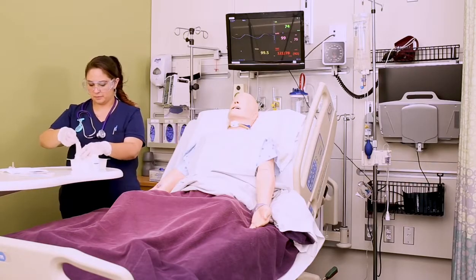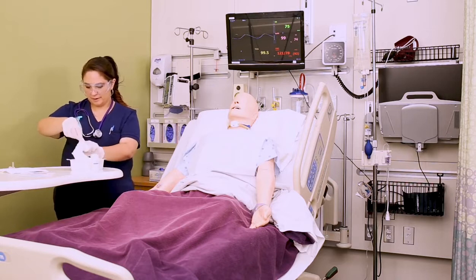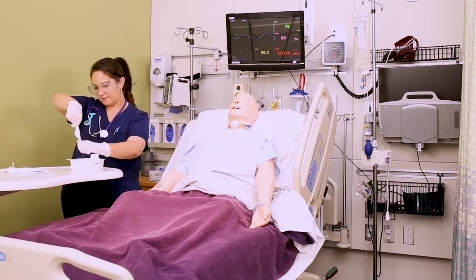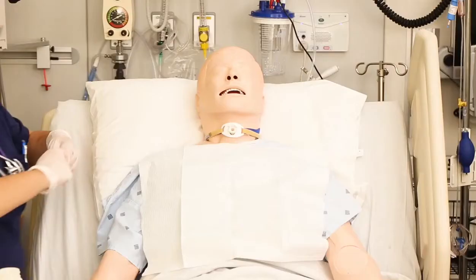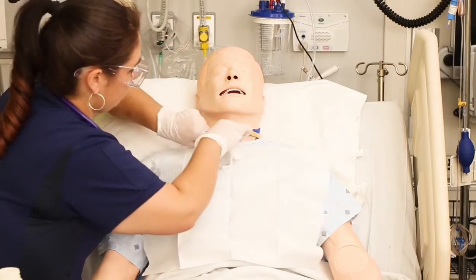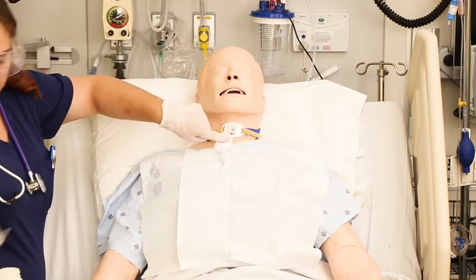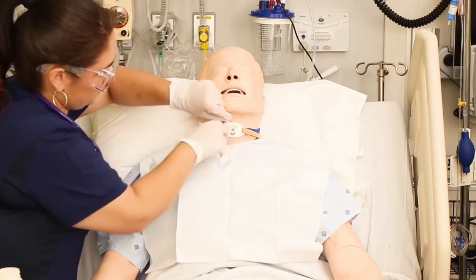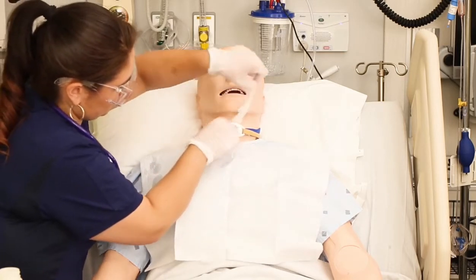So the next thing we want to do is clean under the flange and around the stoma itself. And to do that, we're going to use our saline soaked gauze. So pick up a piece of gauze and wring it out so that it's not dripping. And then you're actually going to feed it up underneath the flange. And if you need to, you can actually grab a clean sterile cotton tipped applicator if you still have one and use that to kind of push it through.